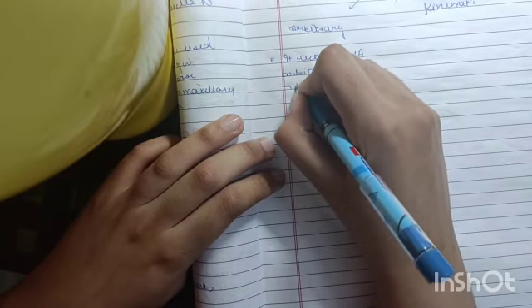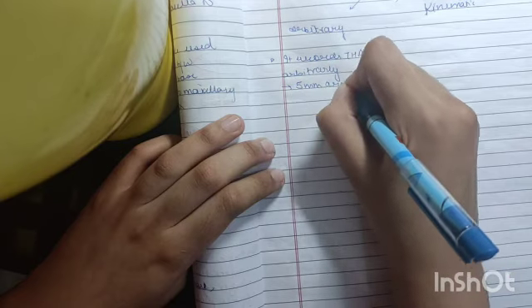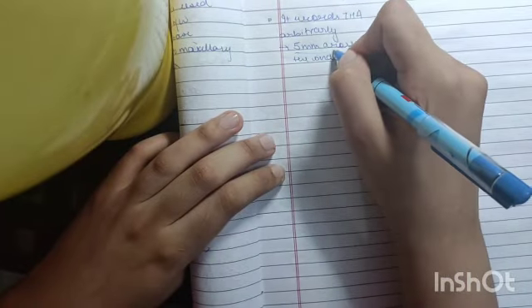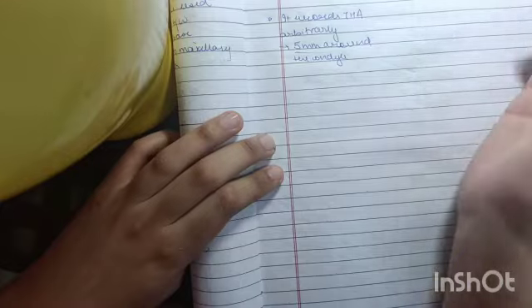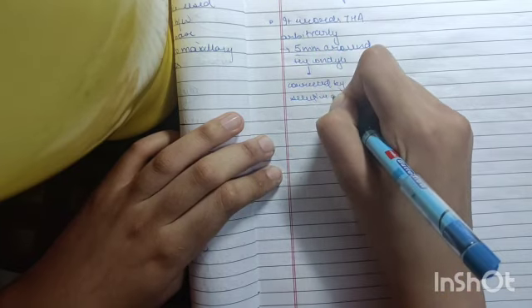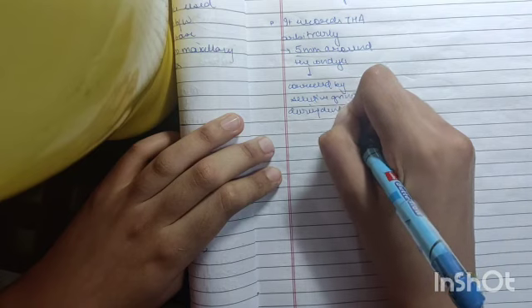It records the transverse hinge axis in the periphery of 5 mm around the condyle. However, when we do the teeth setting, the error of 5 mm around the condyle will lead to an error in the cuspal inclination. So that error is corrected by selective grinding during the denture insertion procedure.